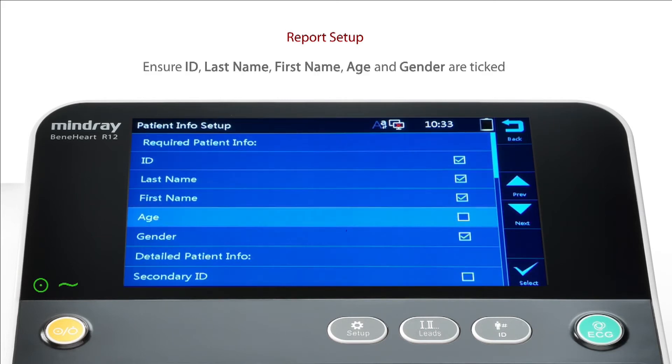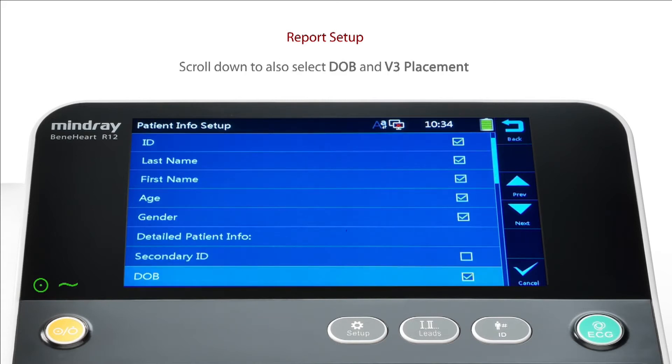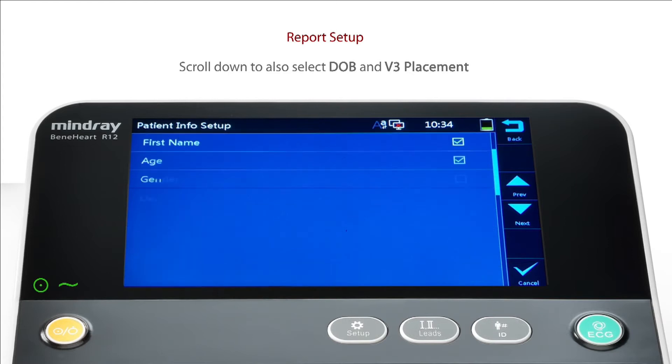Ensure the following boxes are ticked: ID, Last Name, First Name, Age and Gender. Scroll down to also select Date of Birth and V3 Placement.